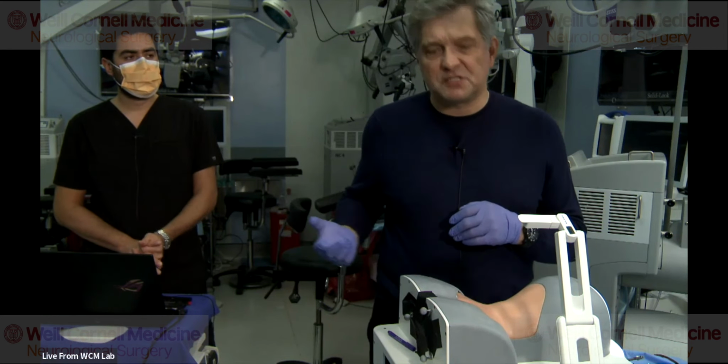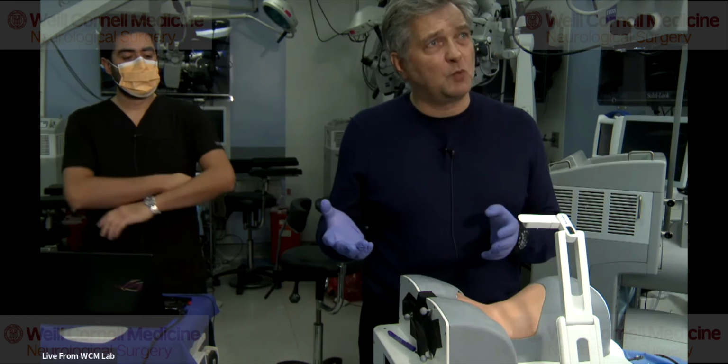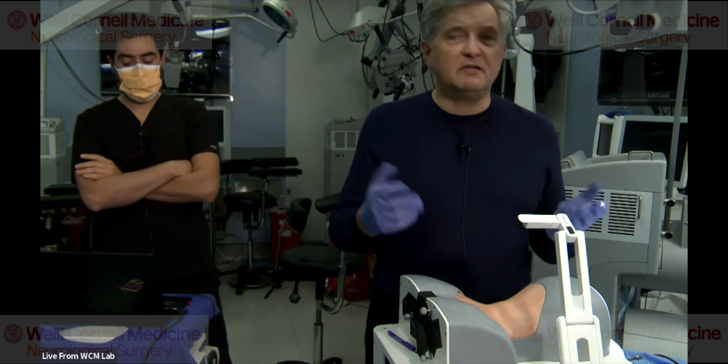And we talked about that at one of the sessions earlier today with Paul Park. Sometimes for localization purposes, especially if you work at C7, T1, you end up getting an AP fluoroscopy shot, and that can be obviously a little bit cumbersome in the OR. With navigation, you don't have any of those issues.